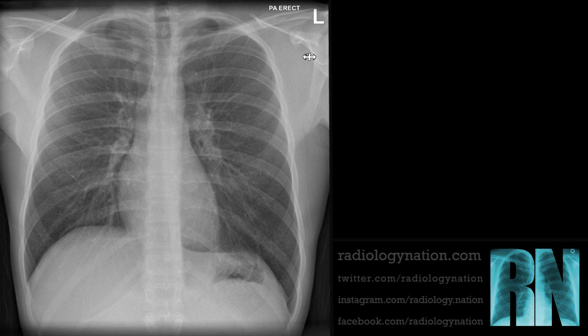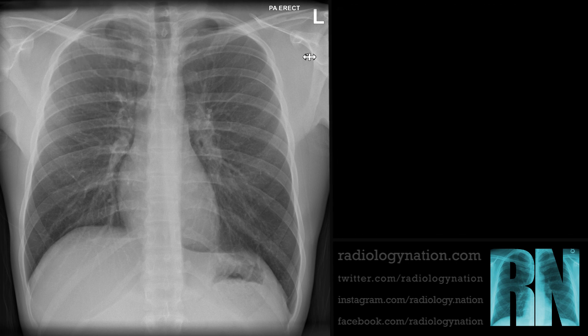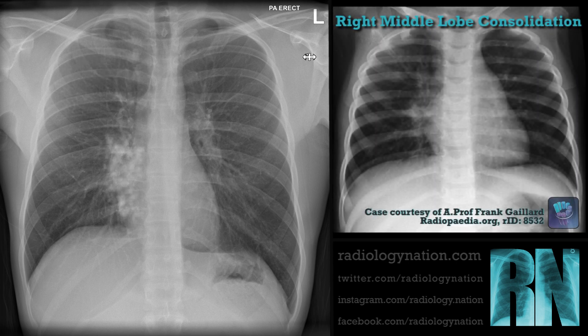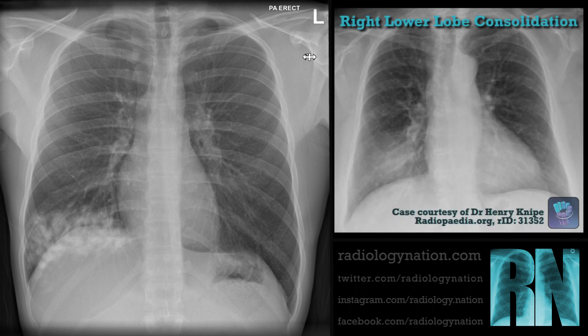We will now discuss the specific radiographic appearances of consolidation in each of the lobes. Consolidation in the right upper lobe will be seen high up in the right lung and will not obscure the heart border or any part of the diaphragm, though the right mediastinal contour may be lost. The right middle lobe abuts the right atrium, so consolidation in this lobe will obscure the right heart border. The right lower lobe sits on the right hemidiaphragm, and consolidation here can obscure the right diaphragmatic contour but will spare the right heart border.